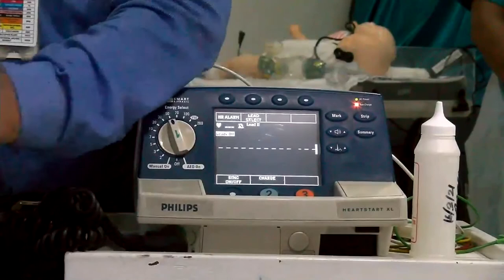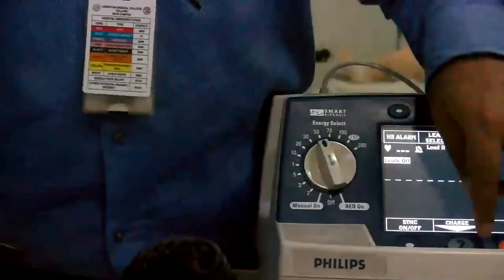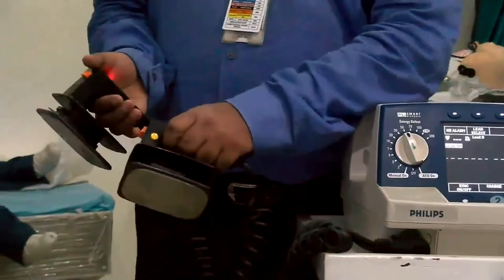The charging can be done by pressing the button here, or there is a yellow button on the paddle which says apex. You can do that as well, either here or the button. You press it to charge. Advisably, you keep the paddles near the patient and then charge, which is better for safety reasons. That's why this button is given.